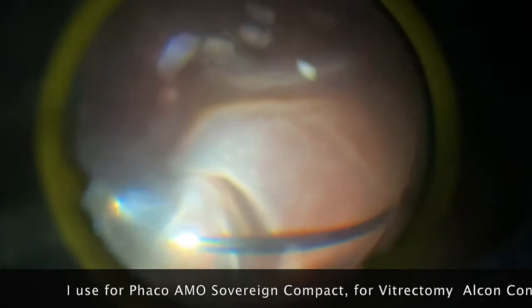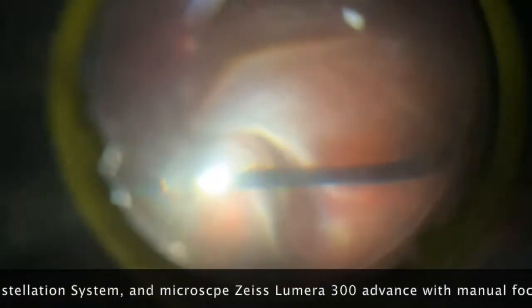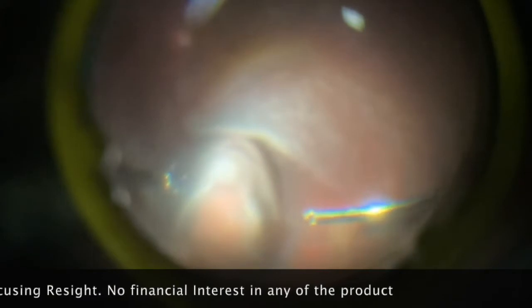I have started indenting, trying to expose the vitreous. The way you indent will actually help you to see the vitreous; otherwise you can be cutting just above or below the vitreous. So you have to really move your indentation in such a way that you can expose the vitreous. One of the best ways to see the vitreous is to look at the side of the indentation — usually the vitreous is more visible beside the indentation. And of course you can also move it up and down to expose the vitreous.